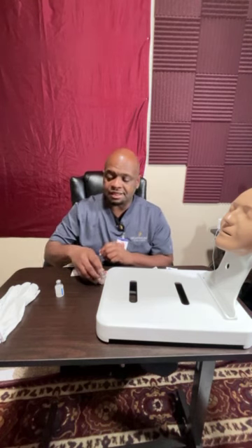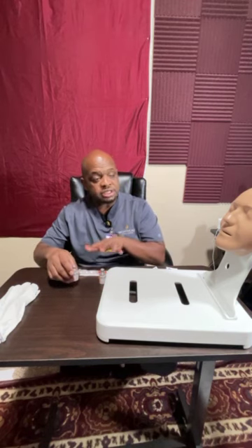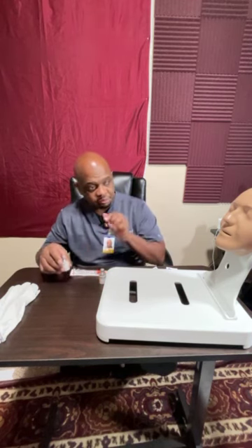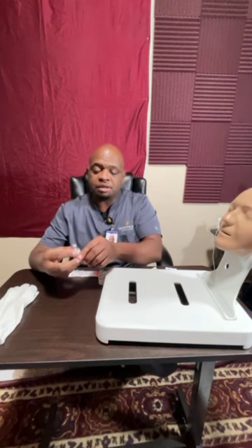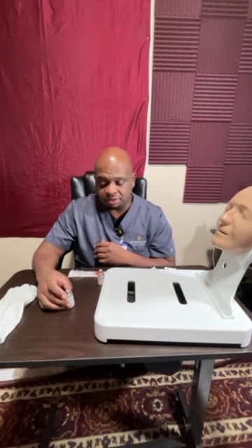You have any questions about the regular insulin? Nope. Okay, gotcha. The other one that we're going to be mixing with it, as I said, because you're going to be getting 2 insulins, but 1 injection. We're going to mix these together. The other one is going to be NPH. This is the intermediate one. It will be in your system a lot longer throughout the day. The peak time for this one is between 2 to 8 hours, right? So that will be in your system a lot longer.